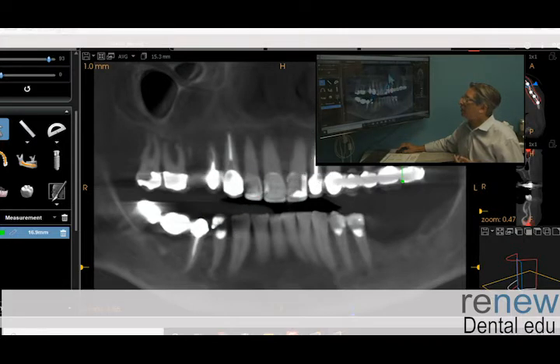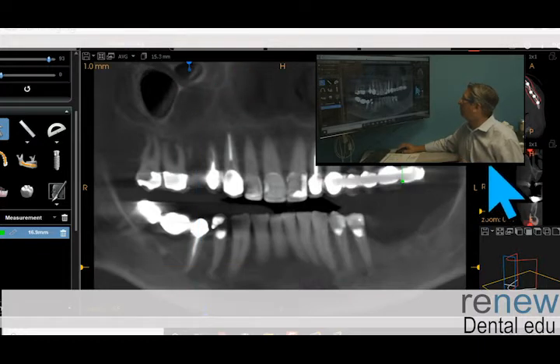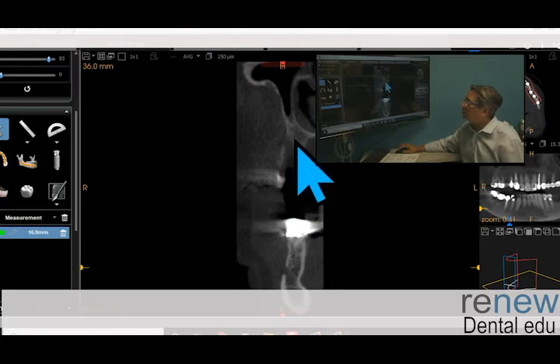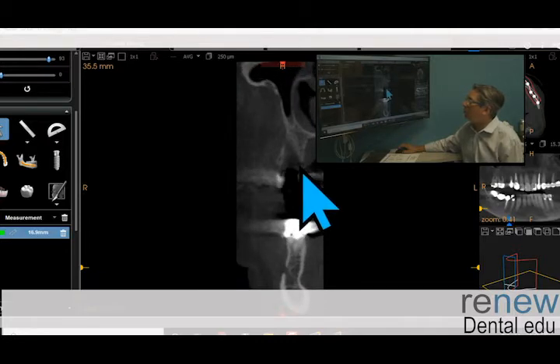So let's look at this site over here, a recent extraction site. Unfortunately, it was not grafted, and that might have led to something more positive here. But you can see how very thin that facial bone ended up. The density looks pretty good in the bone here, but there's absolutely nothing here, and there's a fenestration here in that site. So that's, I don't know, 2 months old. I hope to see more bone grow in there, but that's just the way it is.